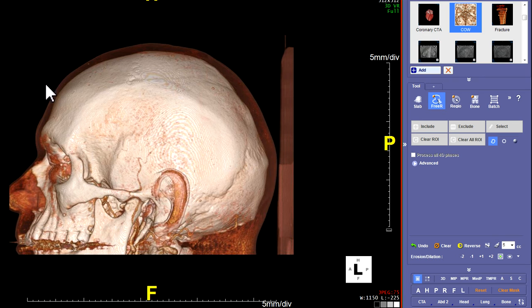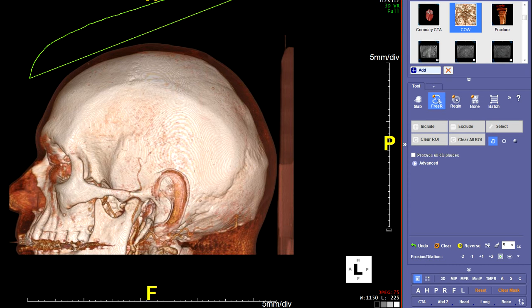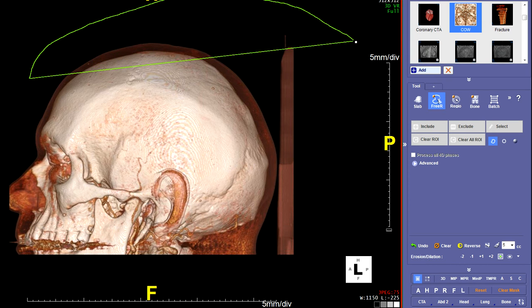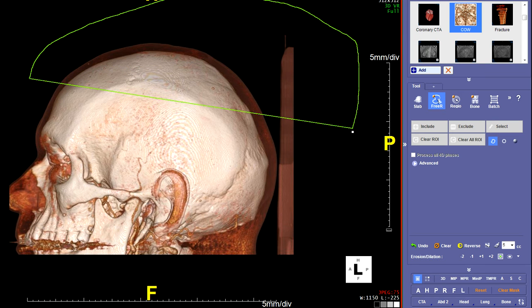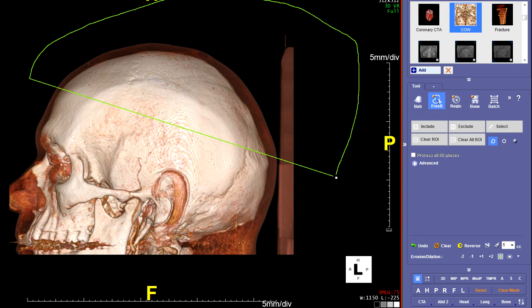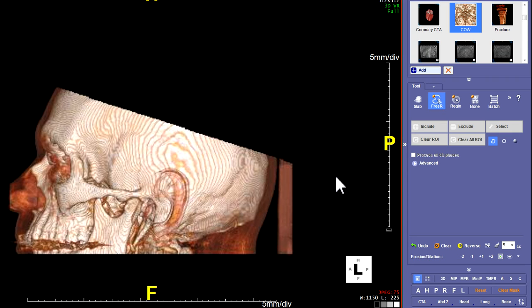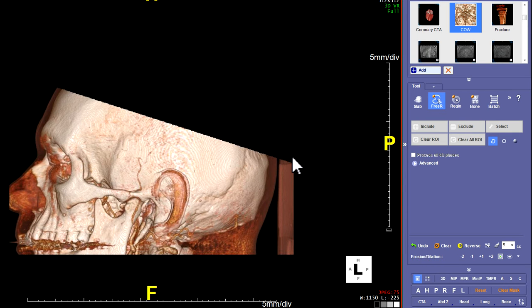We're going to cut the top of the head. Notice how if you go over here, there's an arrow — hold the Shift button down and it turns to a little dot. Go over the top of the head and you get this kind of an arc. Go all over the top of the head and you'll see how it makes a straight edge. Bring the straight edge down about halfway down the head, then let it go and it cuts off the top of the head.